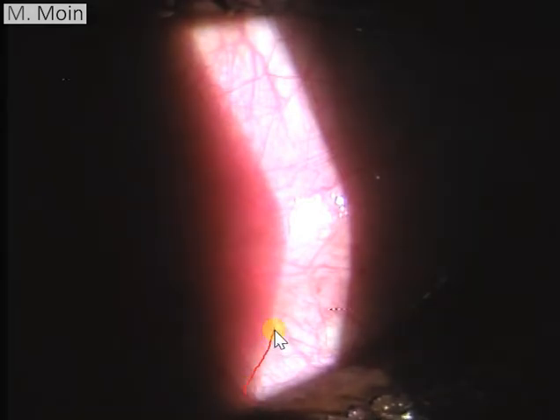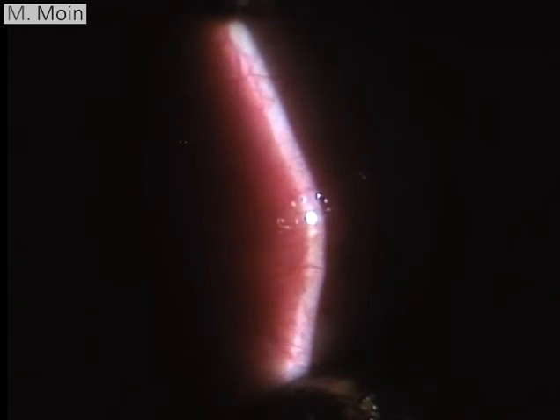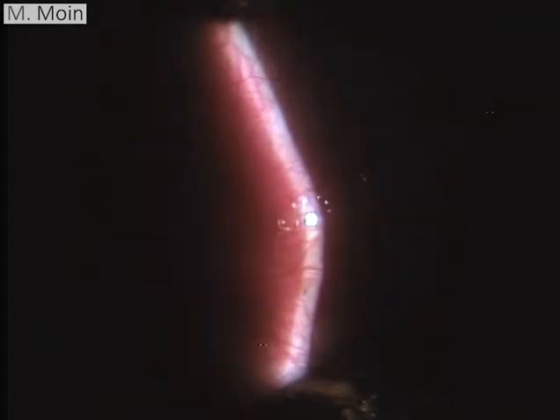is raised. Here you can see there is some elevation in this area. As the slit moves forward, it tends to become flatter, and this is the nodule which is sort of pointing out in the central area. So this is the actual point in this, and let's go forward on this.